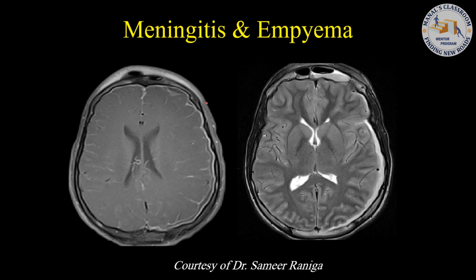Now, if this disease is not treated, it can go on to having a very severe meningitis. So this is an example of a patient that has a meningitis.